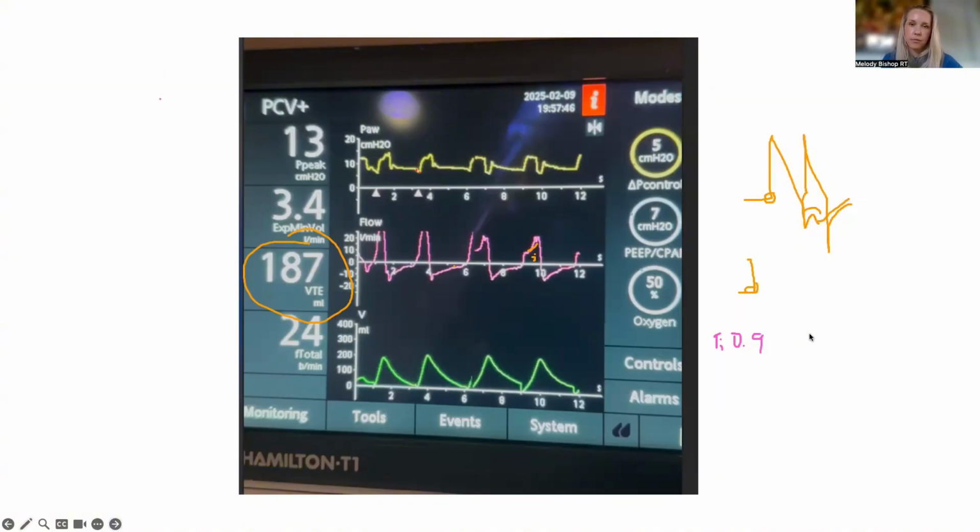Reverse trigger has the inference that you're exposing this Hering-Breuer reflex. Again, I can't say it or spell it, just look it up. That's what it has to do with. It's a fun asynchrony or dyssynchrony to deal with. It can be frustrating, but once you see it and recognize it, you won't ever not see it. It's more pervasive certainly than you would think.